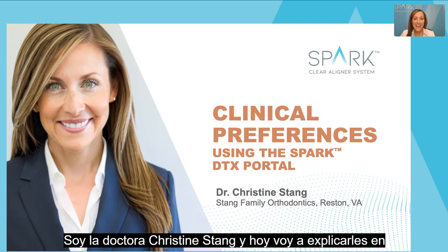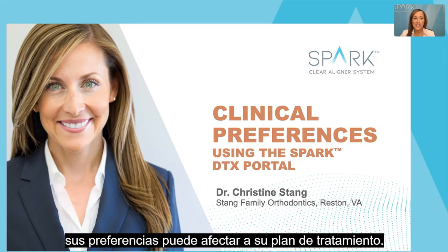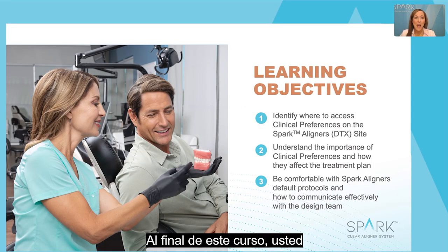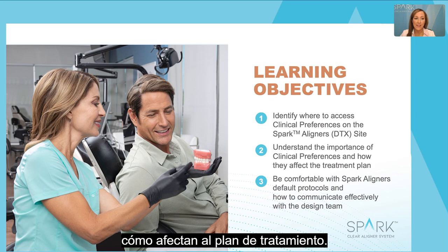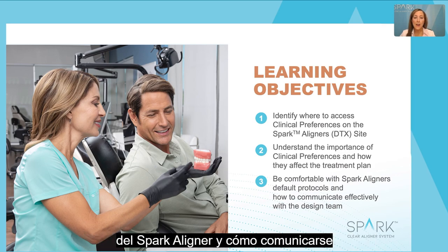I'm Dr. Christine Stang, and today I'm going to walk you through the importance of clinical preferences and how setting up your preferences can affect your treatment plan. Let's dive in. By the end of this course, you will be able to identify where to access the clinical preferences on the Spark Aligner site, understand the importance of clinical preferences and how they affect the treatment plan, be comfortable with the Spark Aligner's default protocols, and how to communicate effectively with the design team.